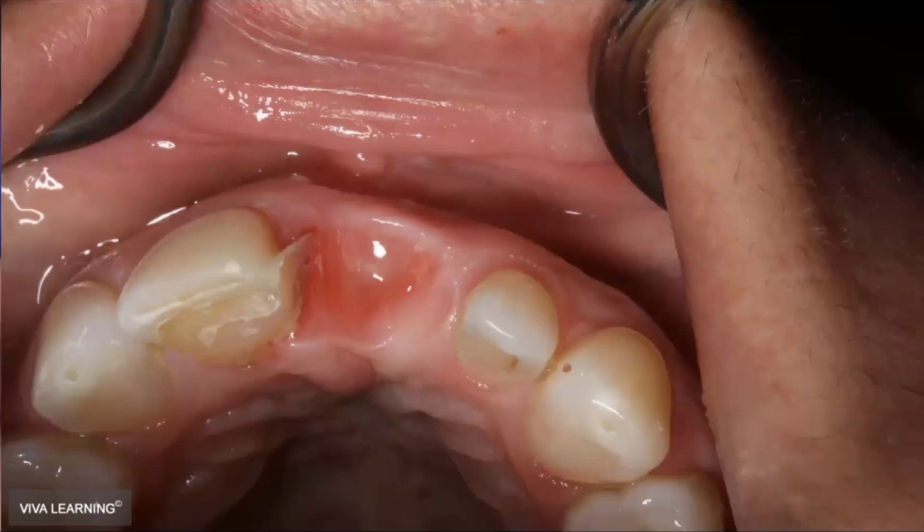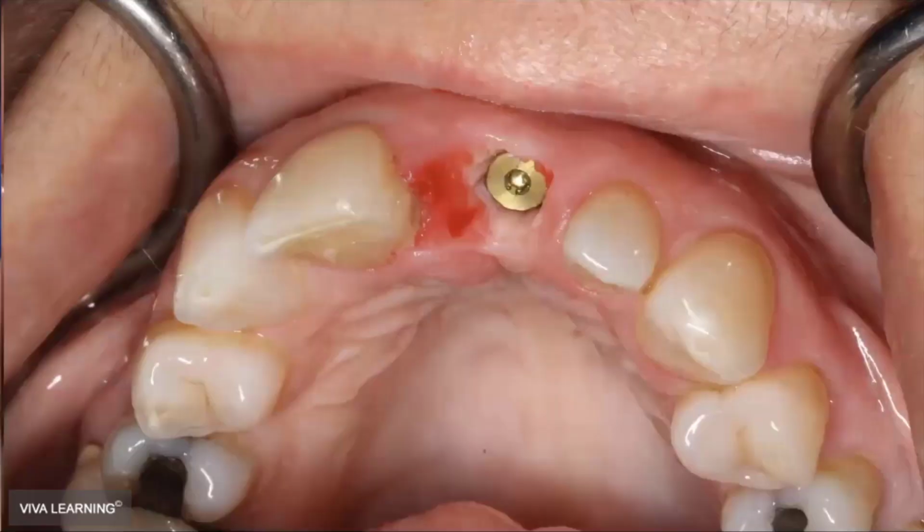And so we've removed the same temporary in this situation, that Maryland bridge. You see all that kind of excessive resin. I might have been a little sloppier the second time around. But we got to remove that with our laser now. And of course, that gingival margin, that papilla is very red from all that resin that's been sitting there, that extra flash, but they will heal from that.